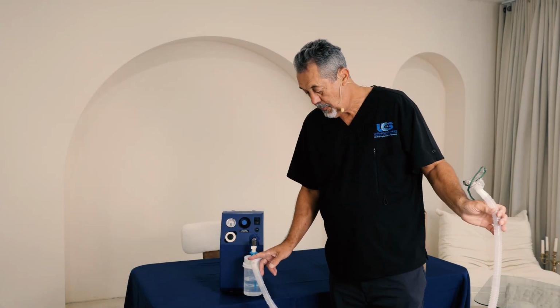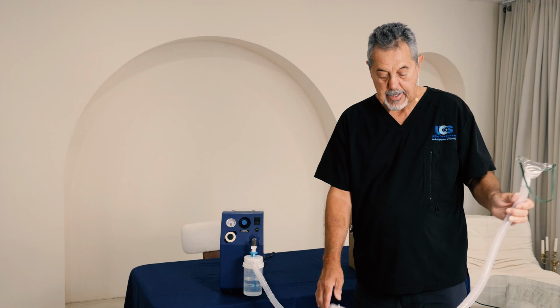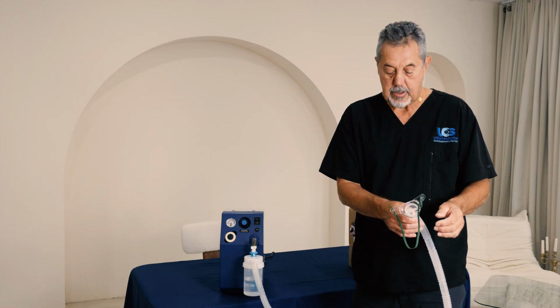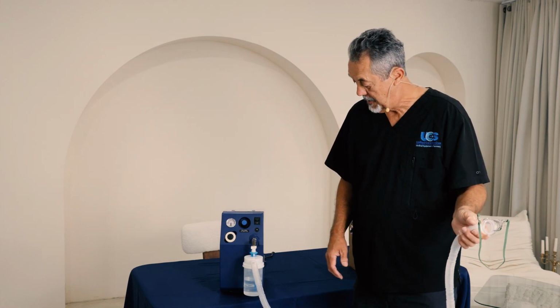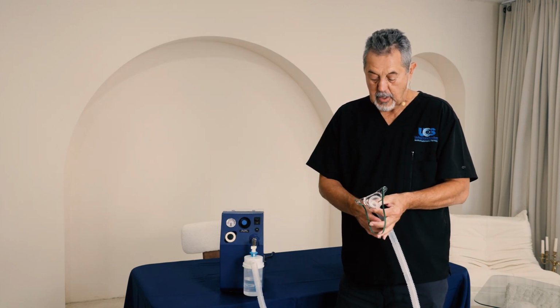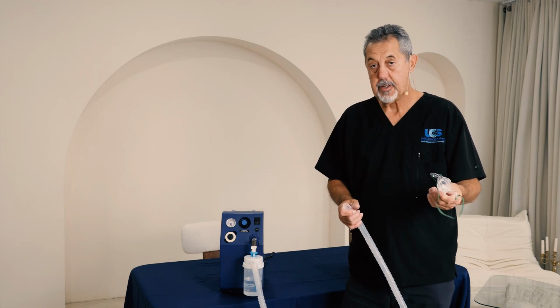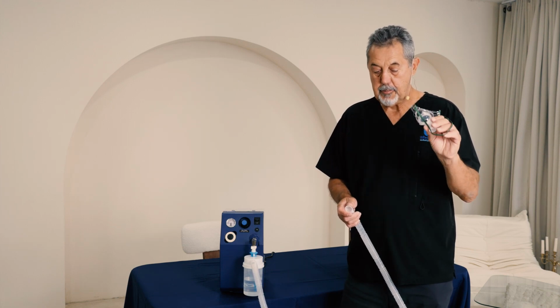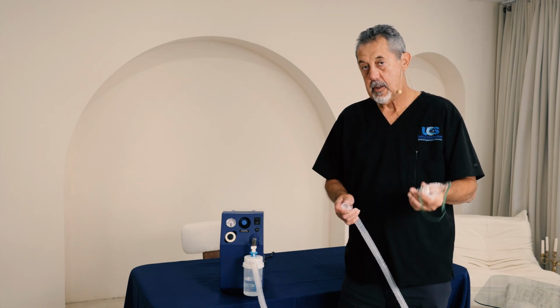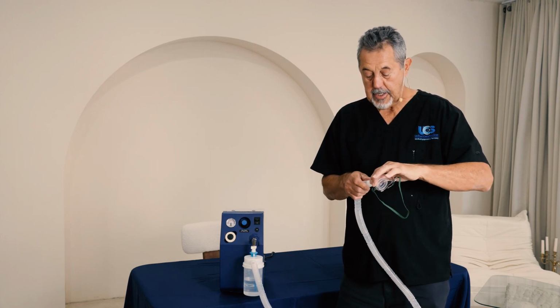So you're going to cut a piece of corrugated that's going to go down. You're going to connect your drain bag, and on the other end, you're going to connect your tracheostomy mask. So replace this whole setup once a week. Your mask, you're going to want to wash this every day with a basic dishwashing soap and water. Keep it clean. The patient is exhaling into this mask all day long, and so that's going to get dirty pretty quick.